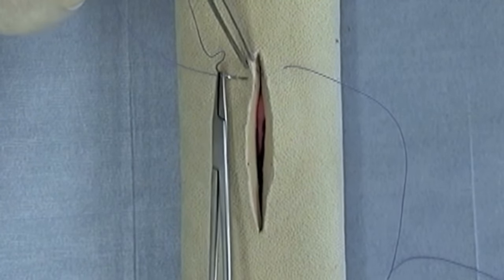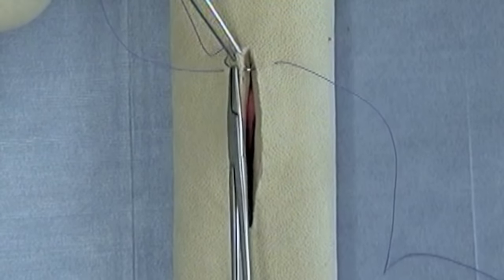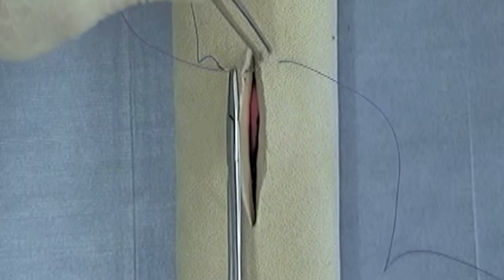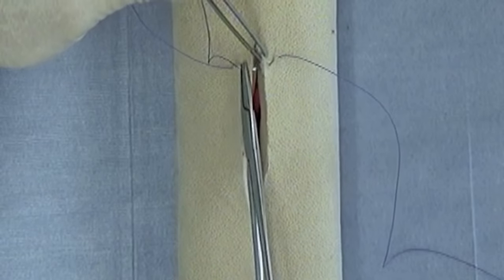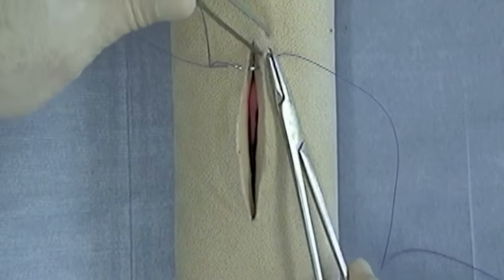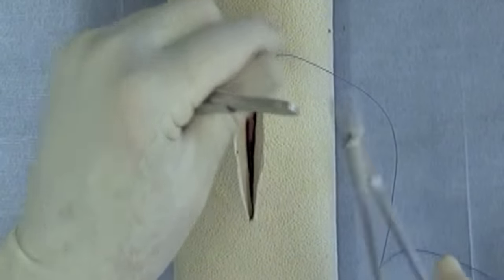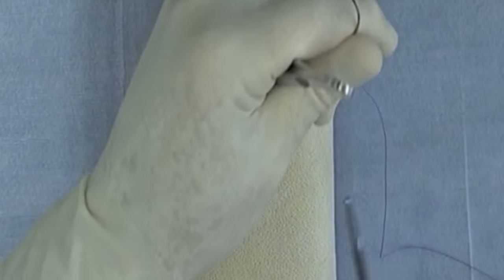These are closer to the skin edge, but full thickness in nature. Sometimes you can come directly across the incision without taking your needle out in between suture bites.